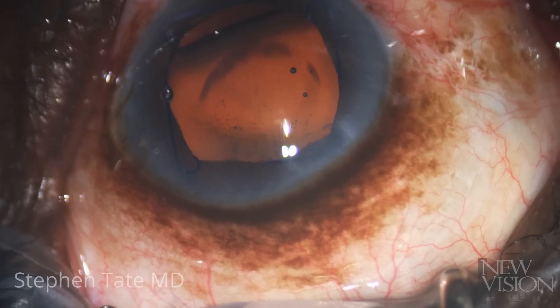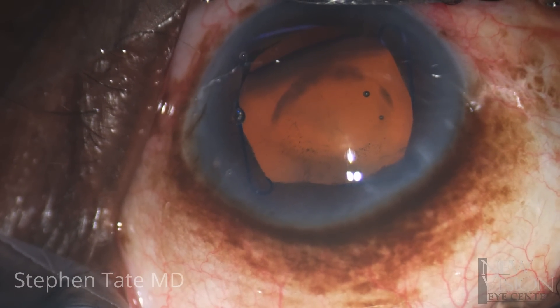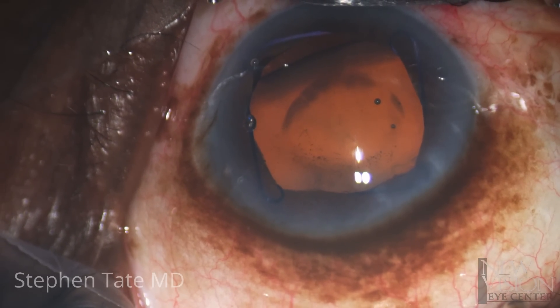His surgery in his left eye began with placement of a Malyugan ring, just as it had in his first eye. After the ring is placed, zonular abnormality was noted inferiorly and the recording begins.